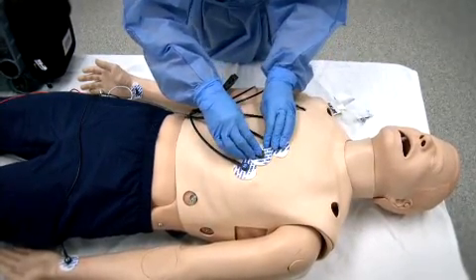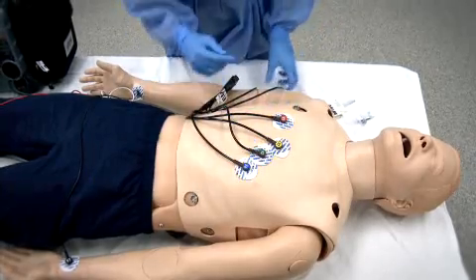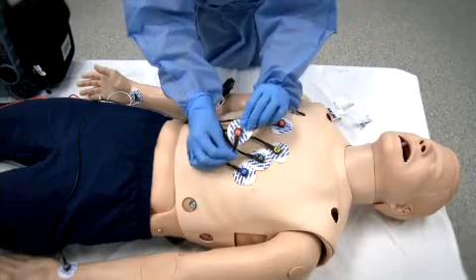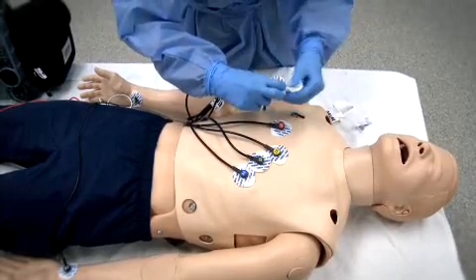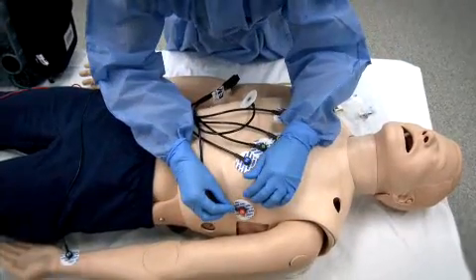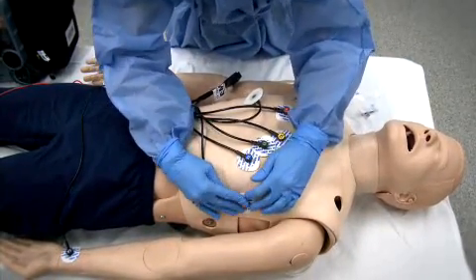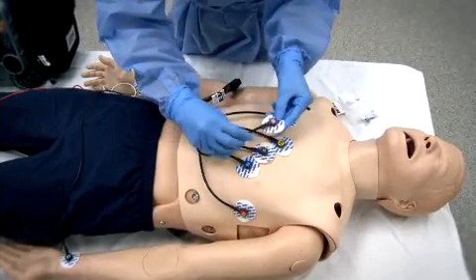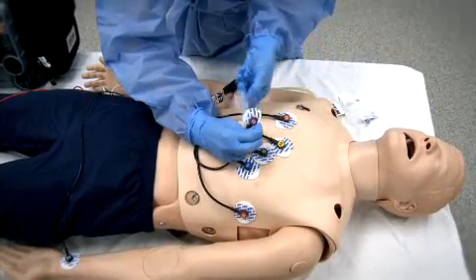The V5 lead is placed at the anterior axillary line while V6 is placed along the mid-axillary line, more lateral to the V5 lead.